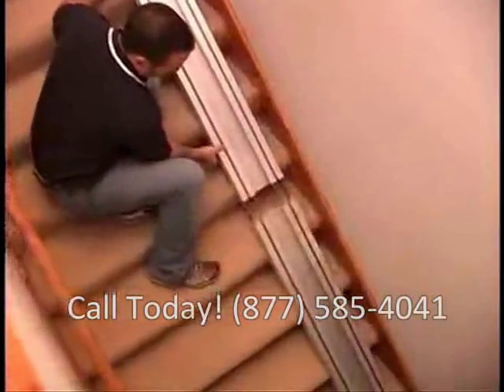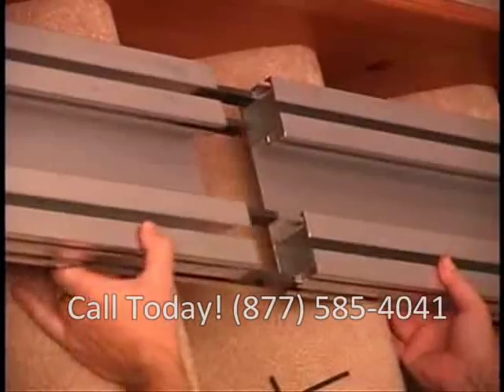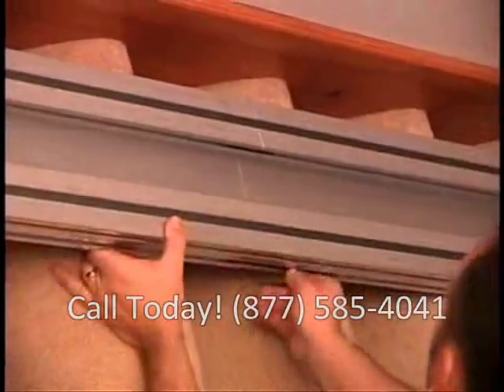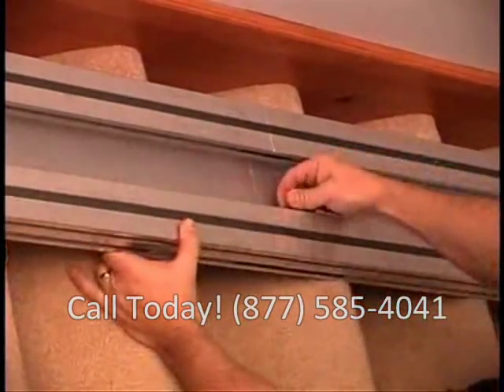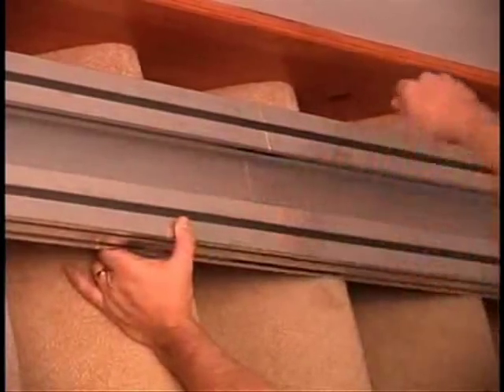Slide the other section of track onto the exposed splice bar and tighten the set screws. Note the track will not slide onto the splice bars if the set screws are protruding. Be careful not to put your fingers between the two sections of track at any time, or injury could occur.